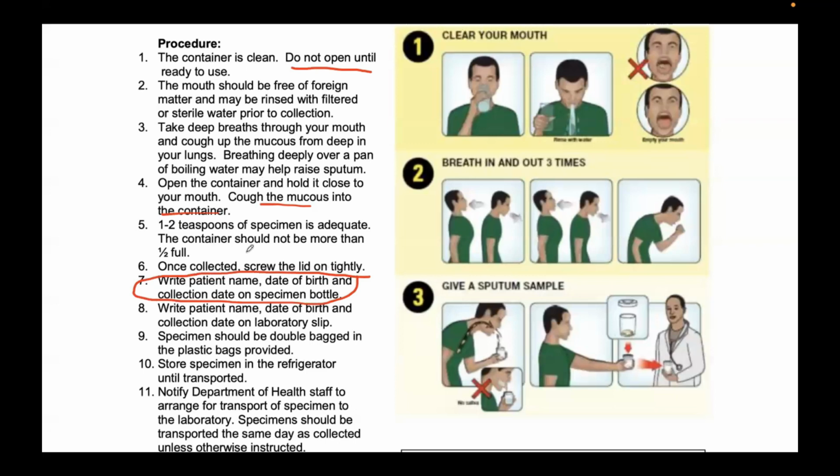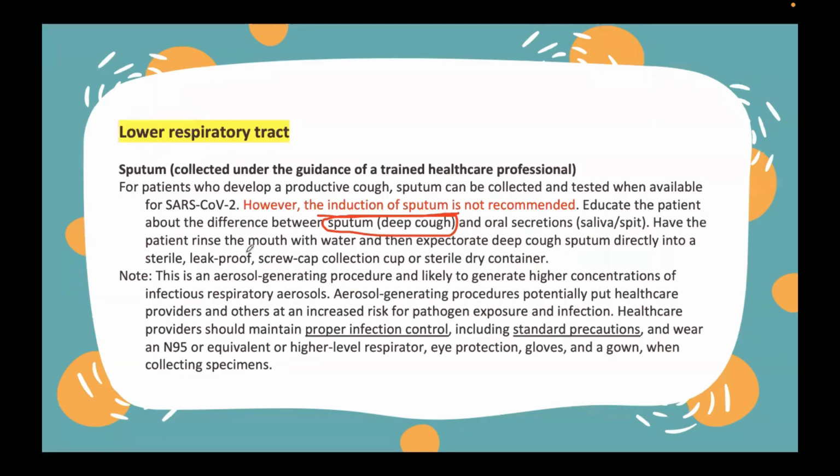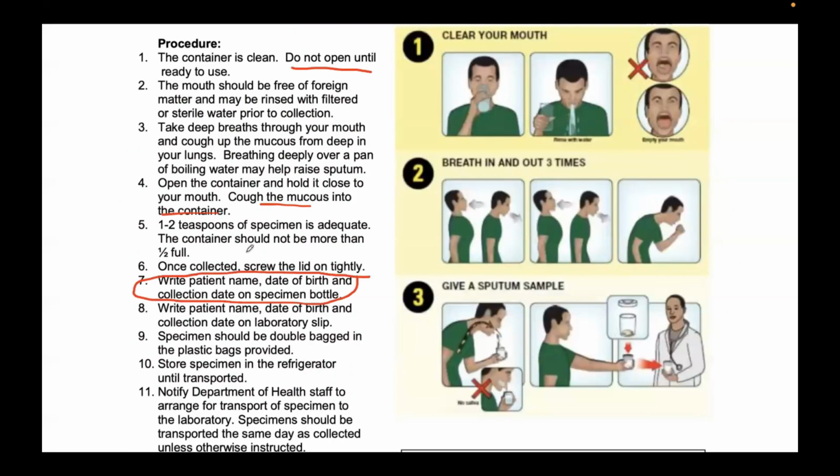So itong mga sputum samples natin to, pwede po itong gamitin sa molecular biology or COVID-19 testing sample, kagaya po ng sinabi ni ma'am, pag hindi po available yung upper respiratory samples. Pero pagka mga induced samples yan, induced sputum, bawal na bawal po yan. And then itong sinasabi ni ma'am na sputum collection, pwede din po yan sa mga microbiological testing natin.